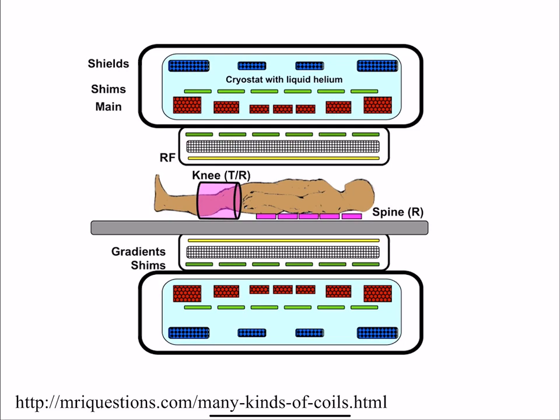So sometimes the only sound you'll hear if the magnet's not being used is the cold head pumping the helium back, like a ba-bum, ba-bum, ba-bum. But we can turn that off sometimes, if we're doing some diagnoses. And even if we turn that off, the magnetic field is still on. So you must always realize that the magnetic field is on, unless you're told explicitly it's off.